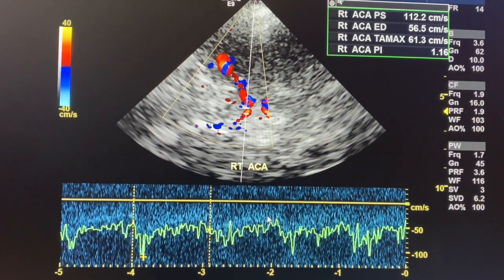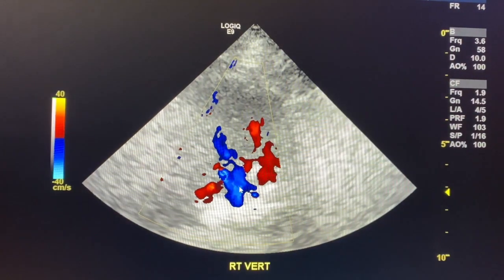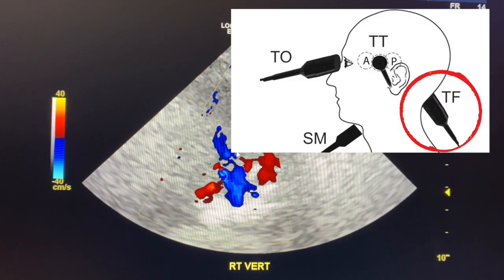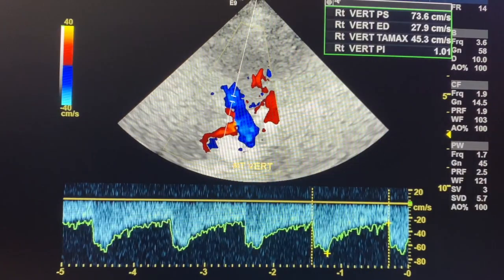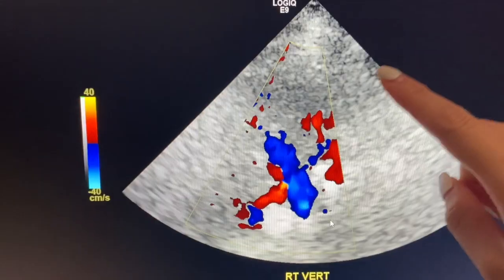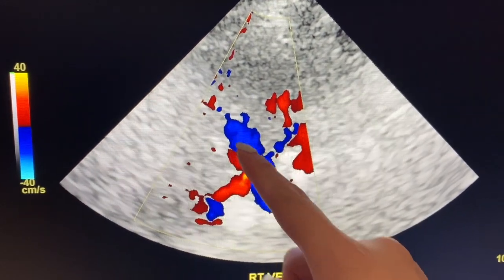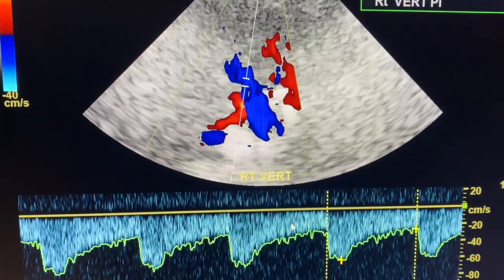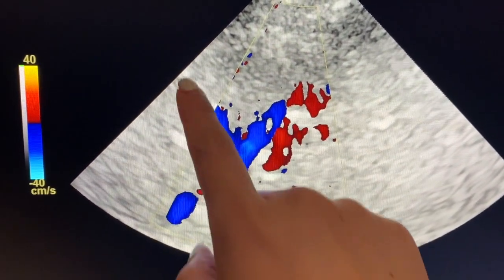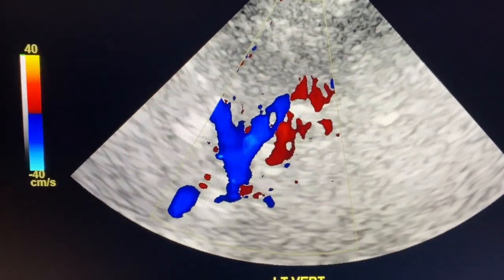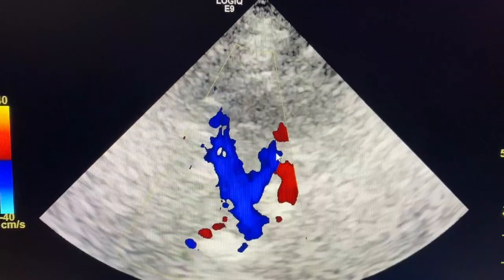You won't always get great pictures, but when you do see it, catch it while you can, because these patients are really difficult to scan — neurosonography is tough. For the vertebral arteries, you can do right or left first, it doesn't matter. You'll usually see a Y-shape, because the transducer notch is to the patient's right — the right indent is the right side and the left indent with the Y is the left side. We survey the vessels on the right and left verts.